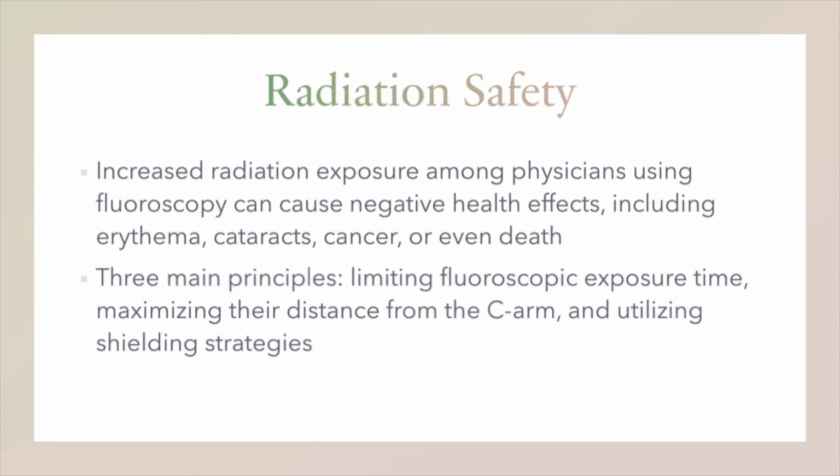An important part of fluoroscopic guided procedures is radiation safety. Increased radiation exposure among physicians using fluoroscopy can cause negative health effects, including but not limited to erythema, cataracts, cancer, or even death. To reduce radiation exposure, one must be educated on three main principles: limiting fluoroscopic exposure time, maximizing their distance from the C-arm, and utilizing shielding strategies.